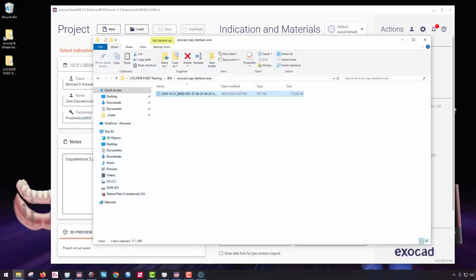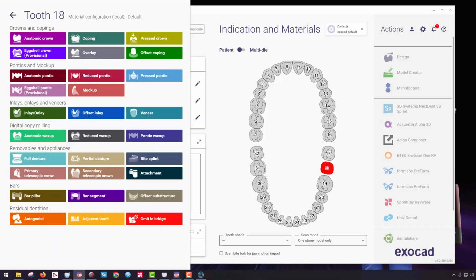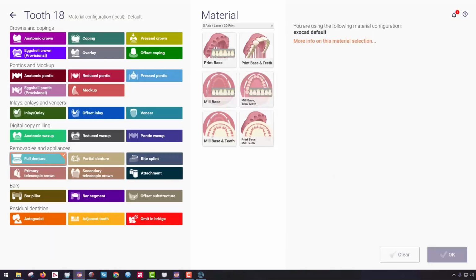No problem. So in exocad, I need to tell the software I'm now going to be doing a copy denture from 18 to 31. So I start out by clicking tooth number 18. I come over here to full denture and click that button and tell the software I'm going to be either milling, printing.